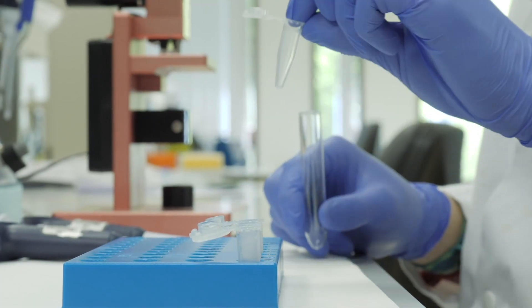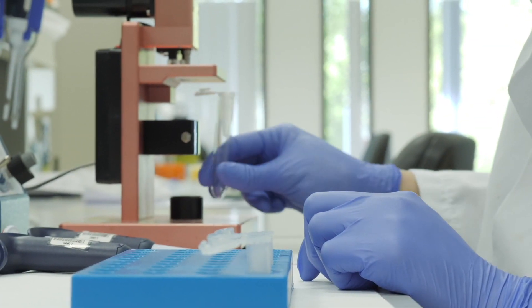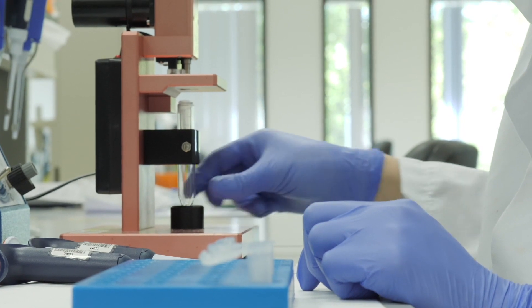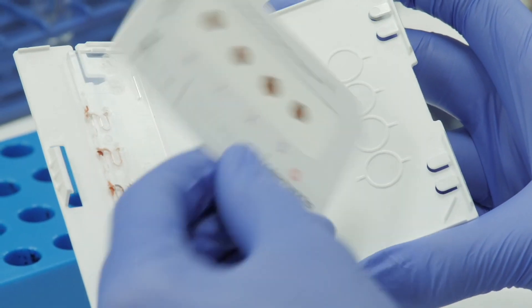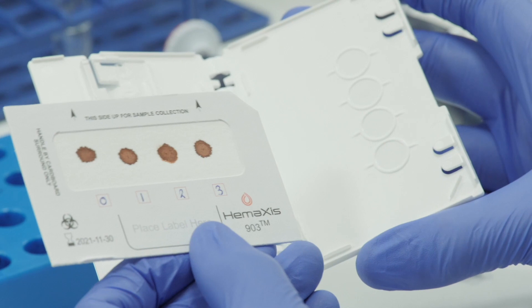After this, the technician readies the test tube. Next, he takes out a dry blood spot card from the holder and puts it in a specialized type of paper puncher.